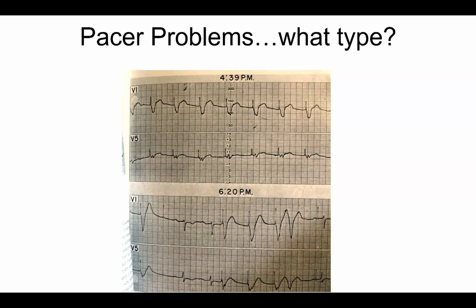So when you put a magnet on a pacemaker, what does it normally do? Does anybody know? It makes it asynchronous. Yeah, it causes the pacemaker to pace in an asynchronous manner.